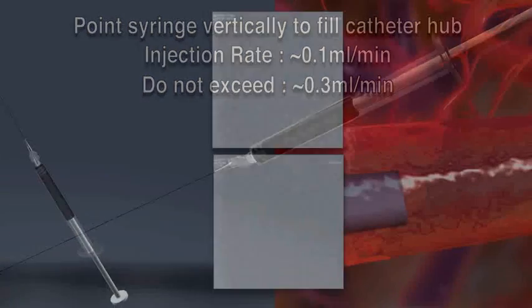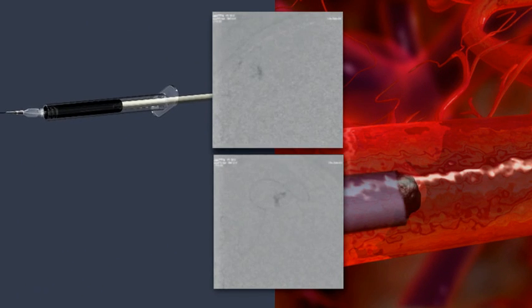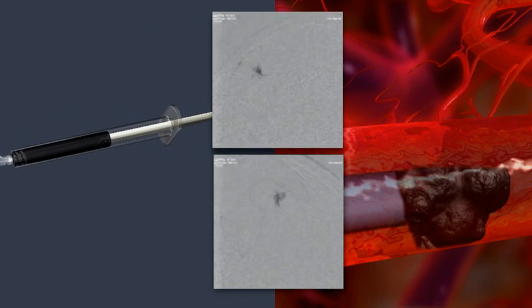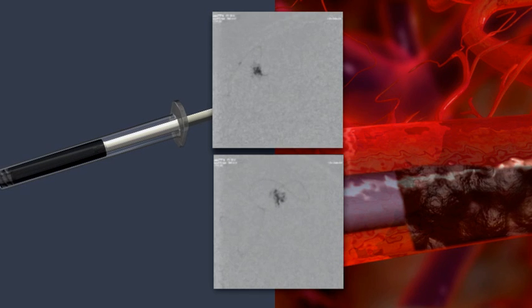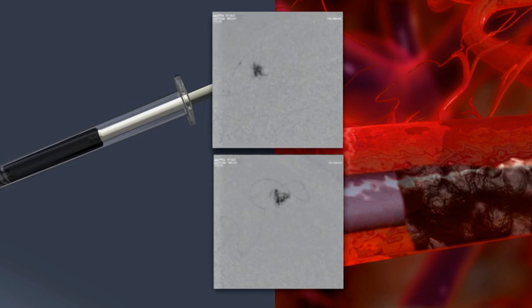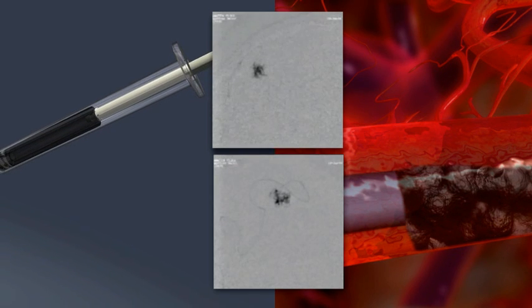Begin fluoroscopic imaging just prior to displacing the catheter dead space volume. If visualization is lost at any time during the procedure, halt Onyx delivery until adequate visualization is re-established.